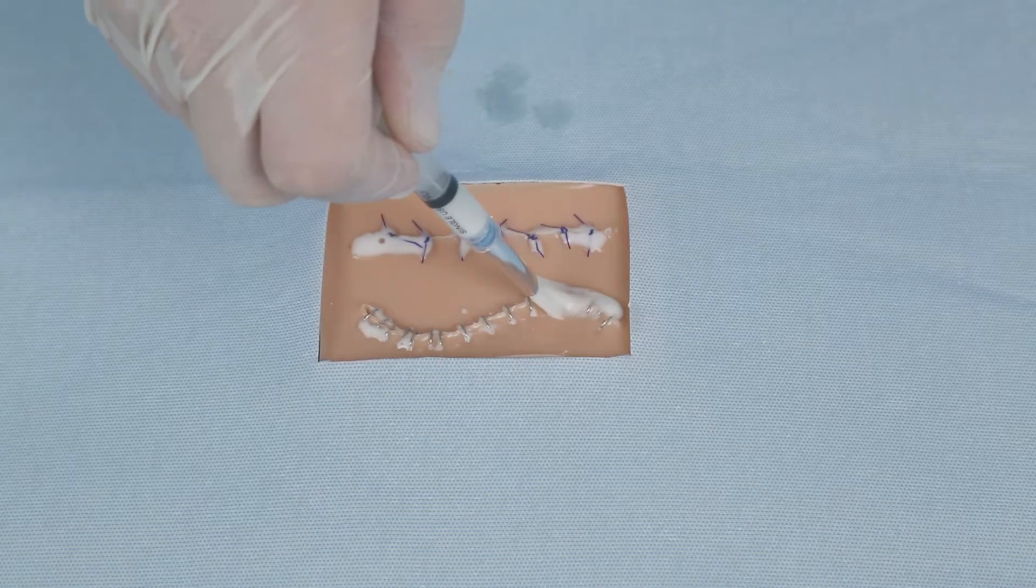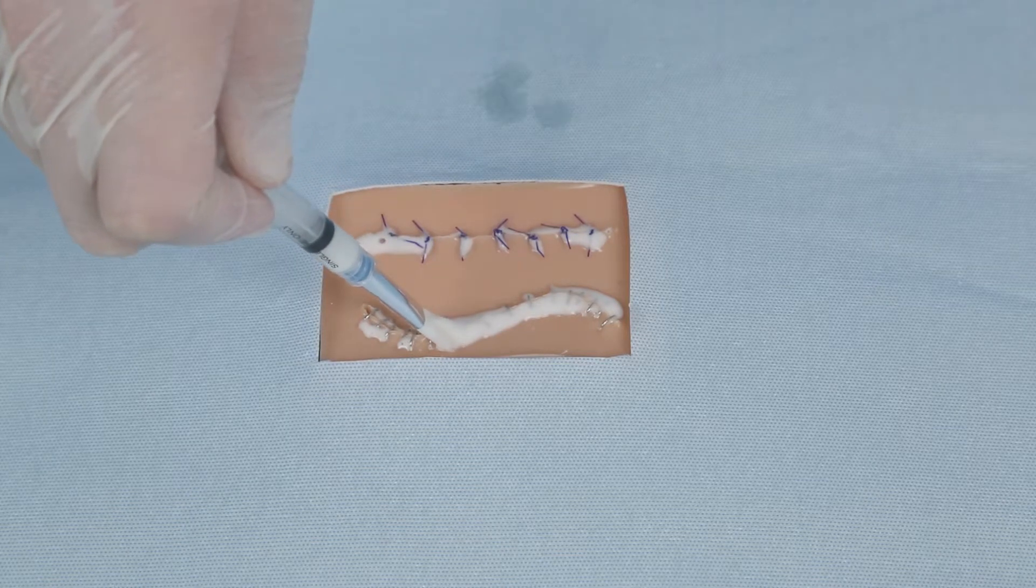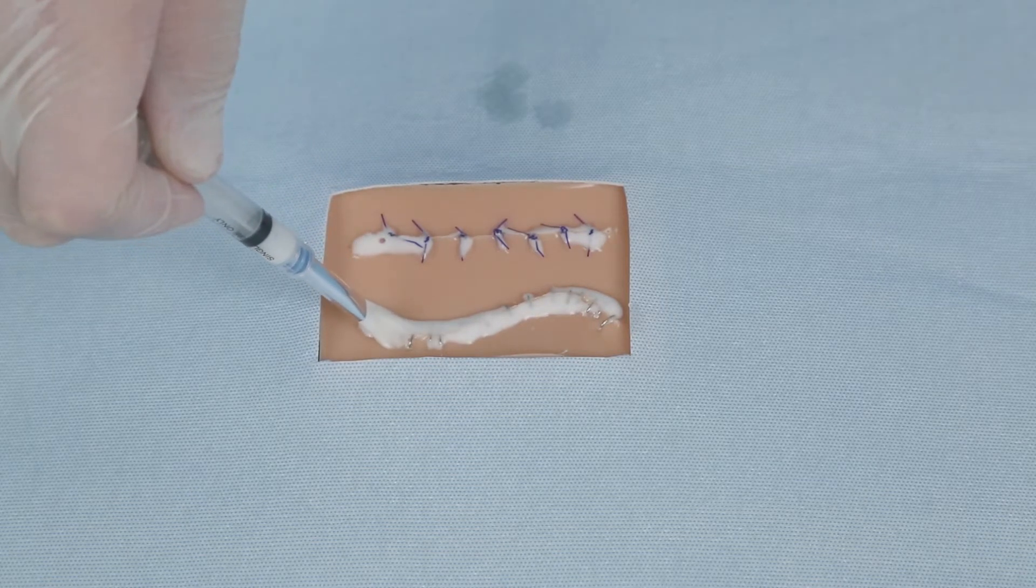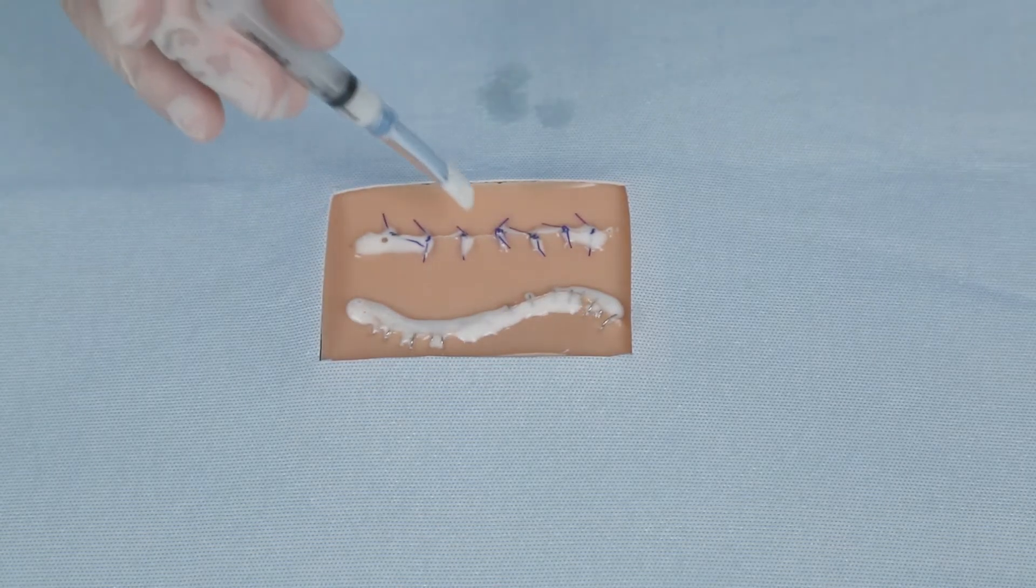Suture Seal will remain on the suture or wound area for approximately 14 days and will biodegrade away slowly. Apply a second application of Suture Seal if the suture or wound is not completely healed after 14 days.